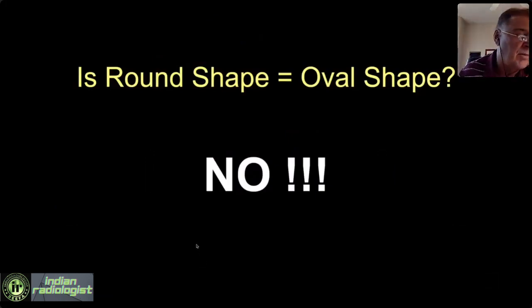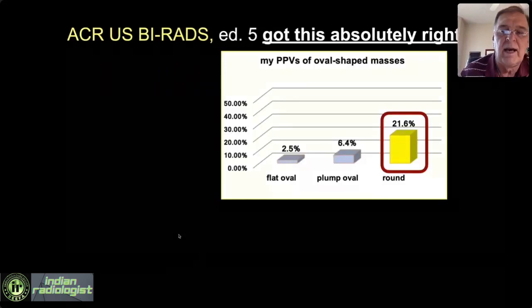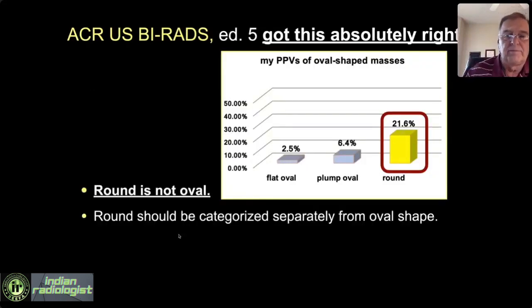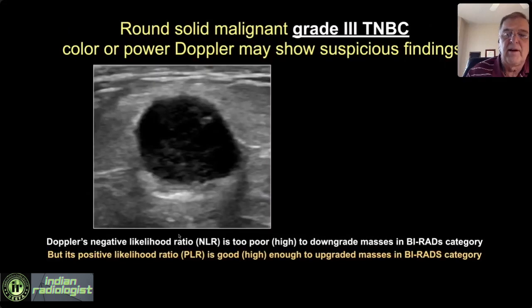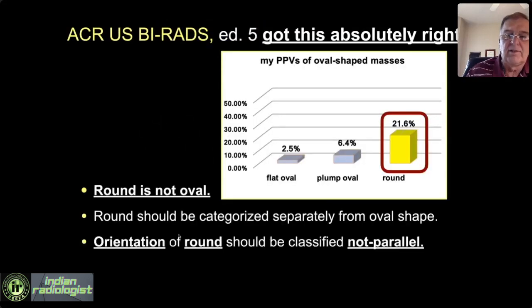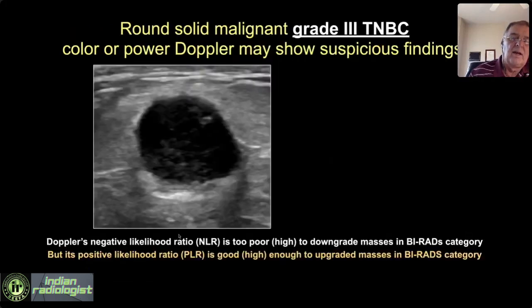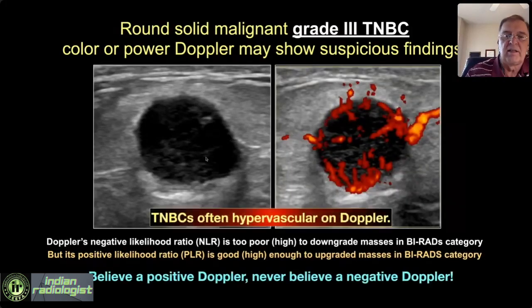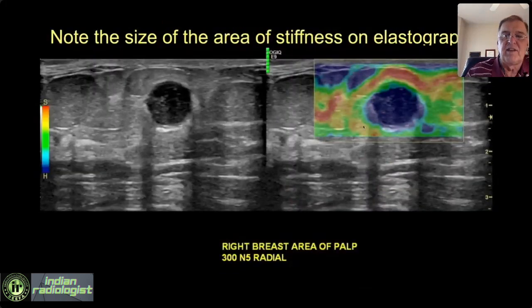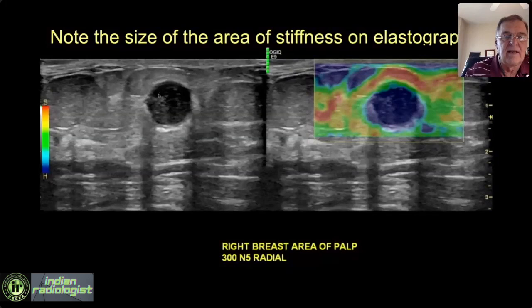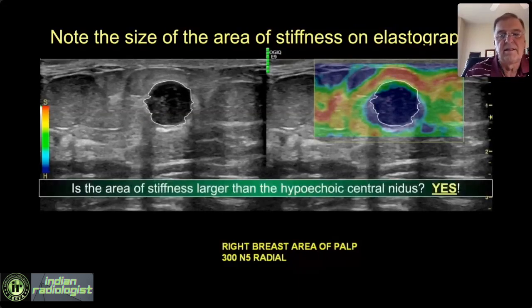The same strict standard applies to round as to oval — approximately round is not round, it's irregular. We want to be strict in our definition of what's round. When I compare my PPVs for round with the readers', theirs was twice that of mine — about 40-some percent — because they were calling stuff round that I was calling irregular. Here's a lesion I called irregular that a lot of readers called round: notice how hypervascular it is, how stiffness extends outside the hypoechoic central nidus into the echogenic rim, and how it has a thin capsule front and back but a thick echogenic rim on both sides with microlobulations. This is not round.